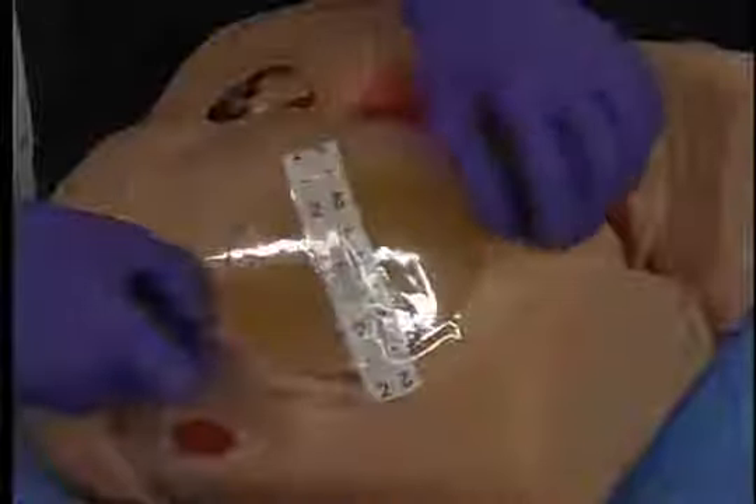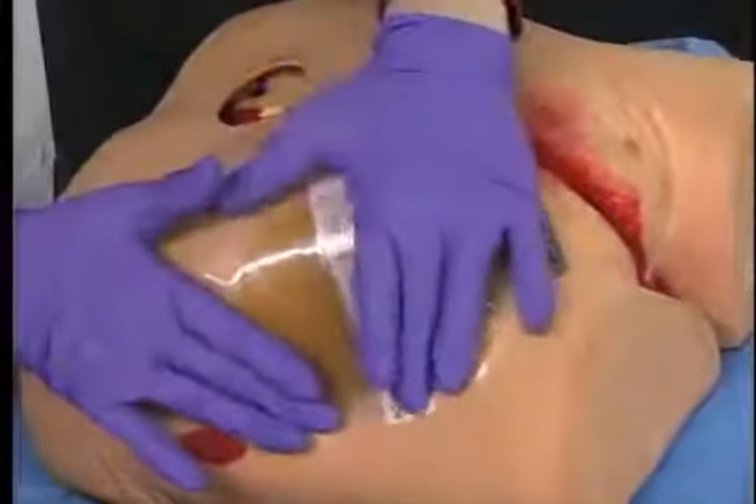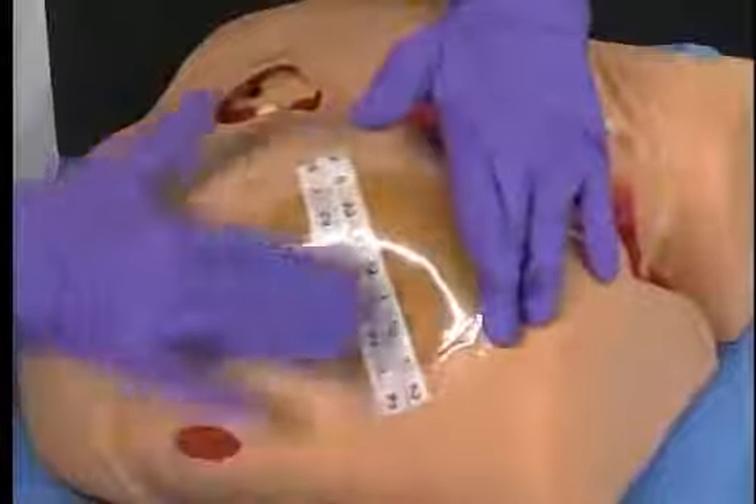Center and gently press the adhesive side of the dressing to the wound site, smoothing the film edges.